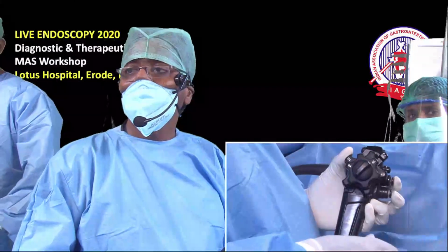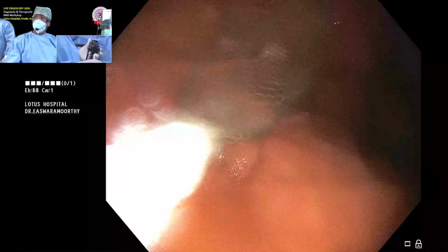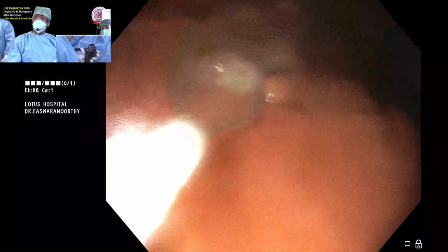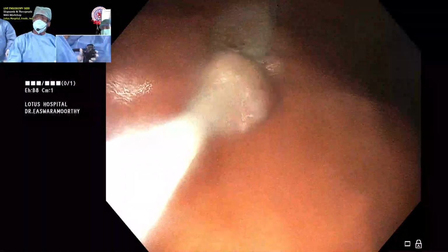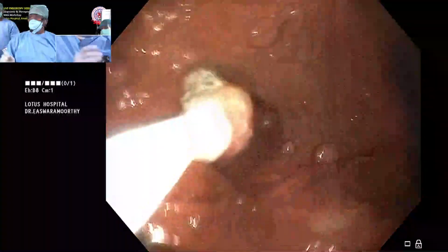Open completely. Close, right. Yeah, close. Yeah, close, close. See, this is easy, like a fish net.